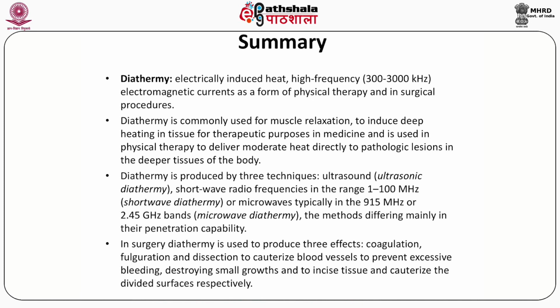Diathermy is commonly used for muscle relaxation, to induce deep heating in tissues for therapeutic purposes in medicine, and is also used in physical therapy to deliver moderate heat directly to pathologic lesions in the deeper tissues of the body.